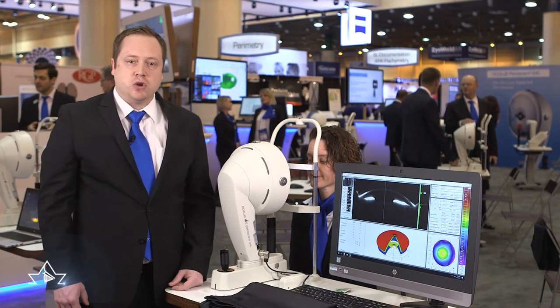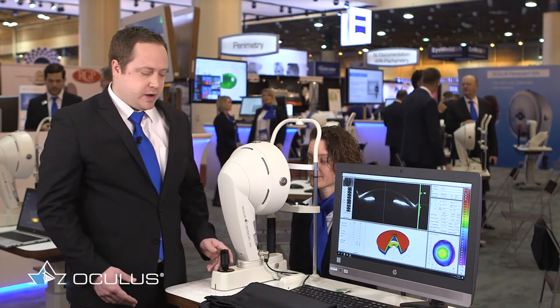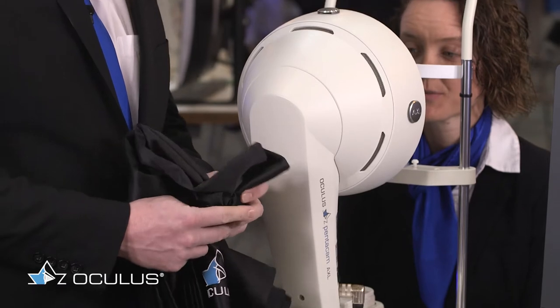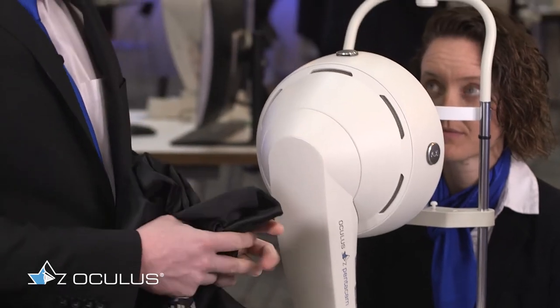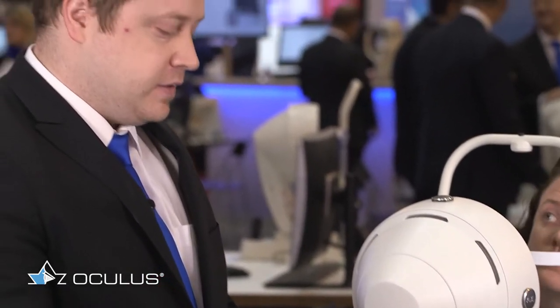I'll start by demonstrating the ease of use of the device. Normally we do the scan in the darkroom but in this case we'll go ahead and use the cloak.